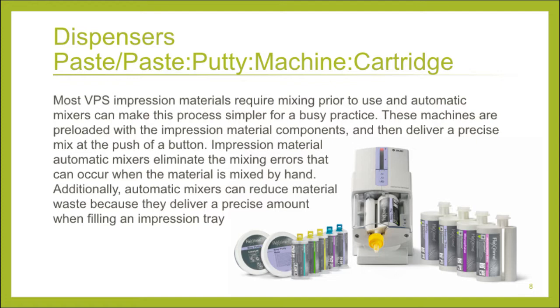So just think about that, and how many impressions you are taking, and double check what that fee may be, because it's really important to think about it. I'm going to get more bang for my buck if I use a larger machine and not just the cartridges.